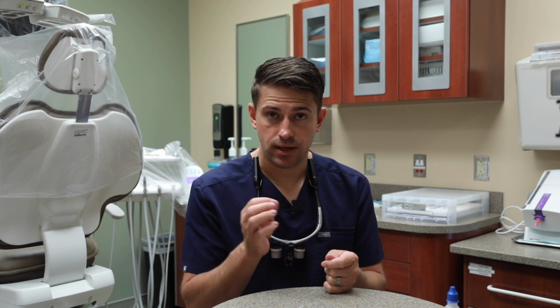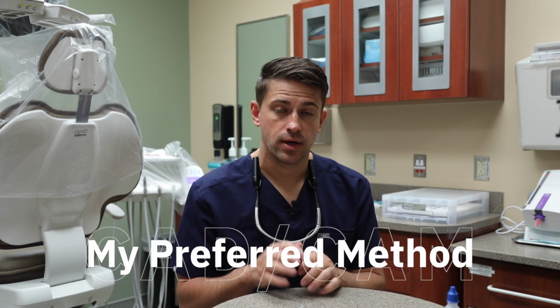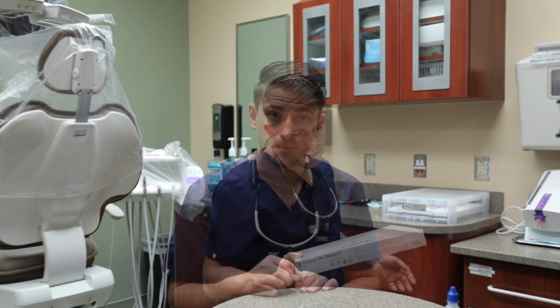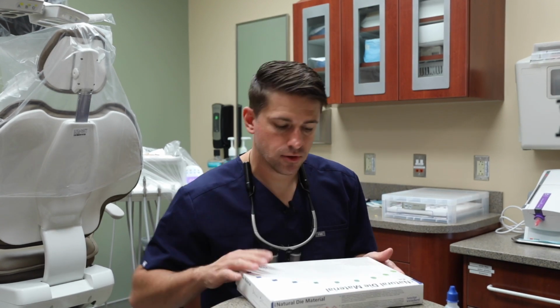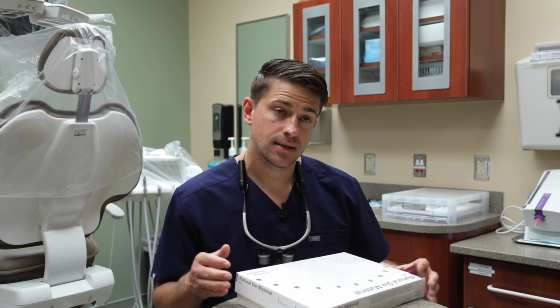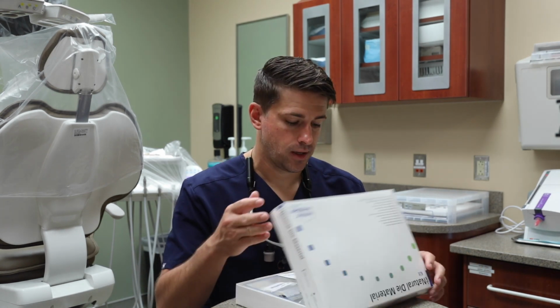So I could do this one of two ways. I could reapply Object Fix to the crown and put a crystallization pin back in there just like we did earlier, and I could apply the glaze onto the crown doing it that way. Or I could use what's called the Natural Die Material, and you heard me talk about this earlier. So the Natural Die Material is made by Ivoclar Vivadent. This is designed to basically replicate the color of the prep.